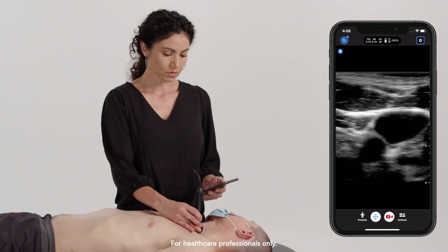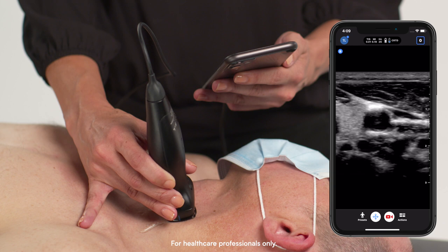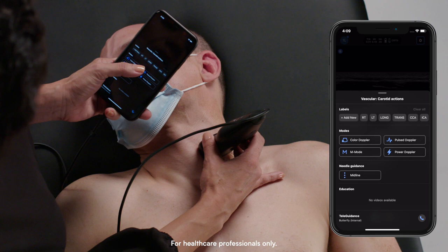I can slide my probe superior towards the patient's head to do a quick survey. If I wanted to take a pulse wave tracing, I will tap my actions menu and select Pulse Doppler under modes.